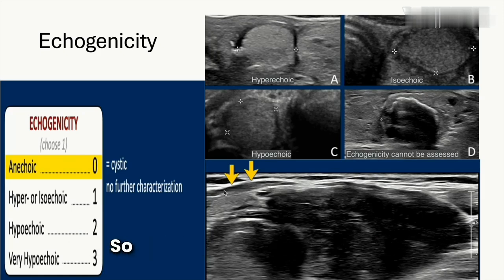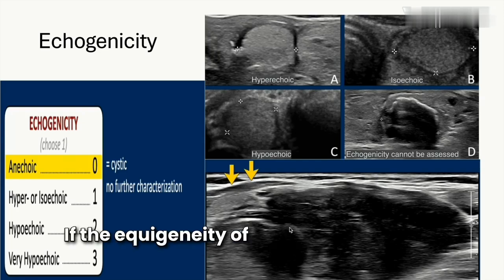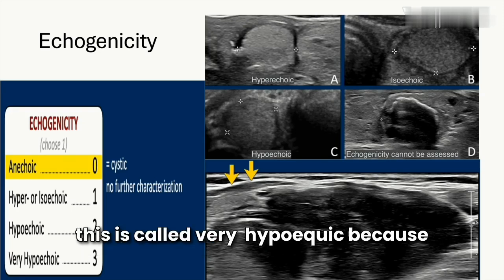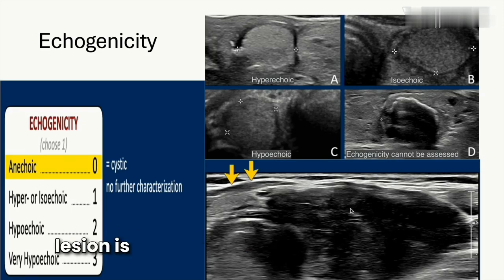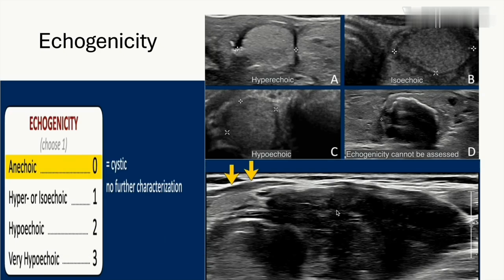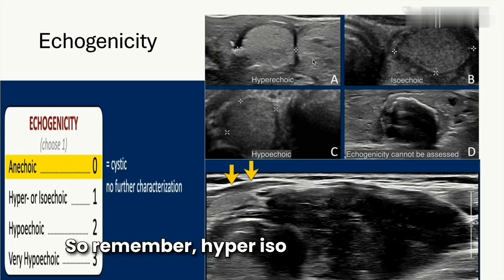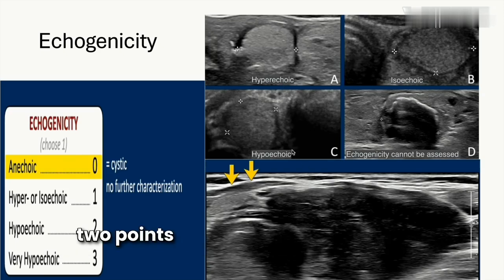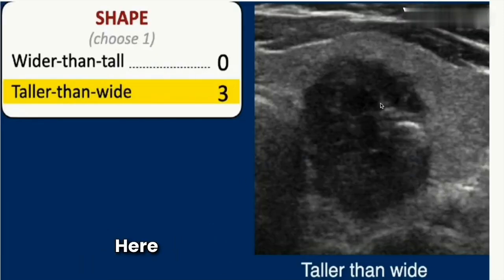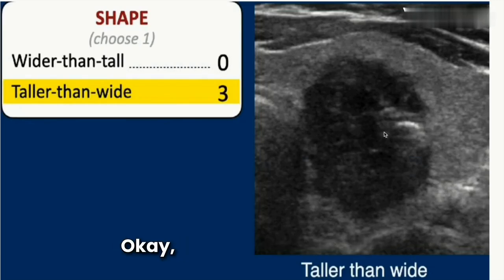These are the strap muscles in front of the thyroid gland. If the echogenicity of the thyroid lesion is at least as low as that of the muscles, it is called very hypoechoic, and a very hypoechoic lesion is highly suspicious for malignancy. To summarize: hyper/iso = one point, hypo = two points, very hypoechoic = three points.